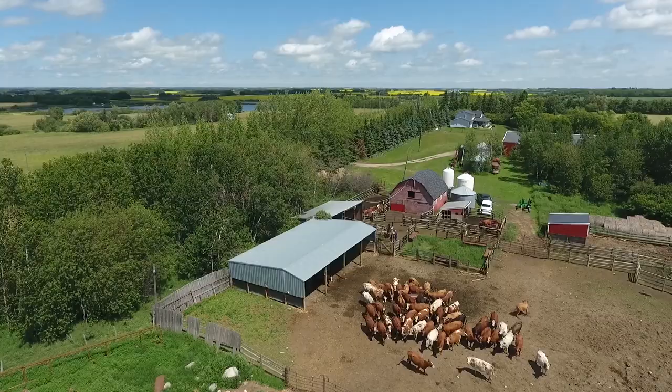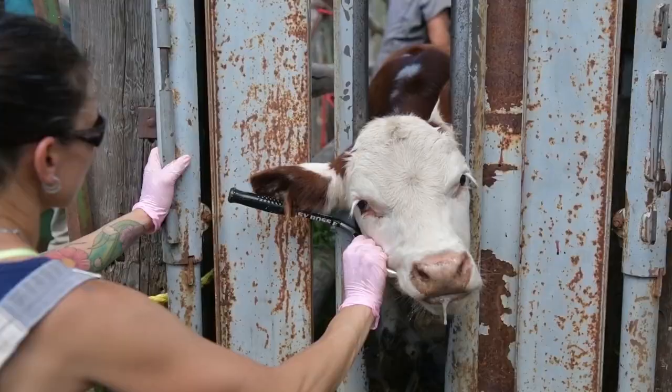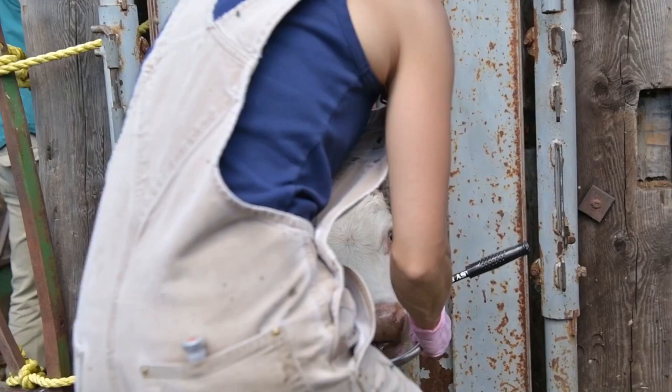We use it in clinic and on farm in pretty much any circumstance that a veterinarian would need to handle or control the head in particular on livestock, immature or mature — it has shown its advantages.